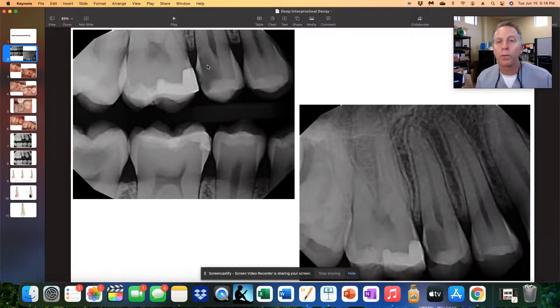Here's the case: tooth number four. The patient came in and had this large area of decay. As we all know, decay starts from the enamel, creates an opening, and then once it gets to the dentin layer — the DEJ — it spreads out. As it continues, it goes towards the pulp. For this individual, we had to remove all this decay; it went into the pulp, and of course we did a root canal.